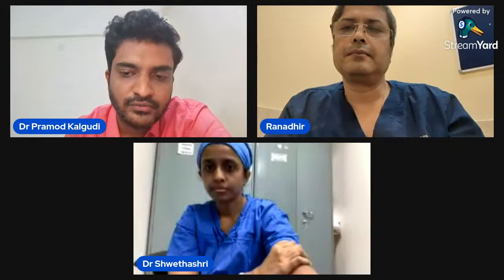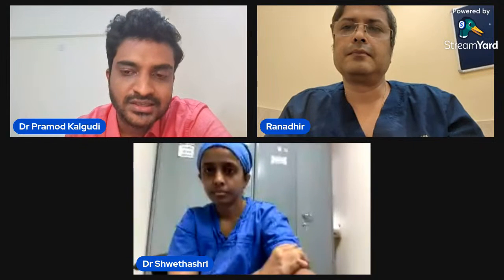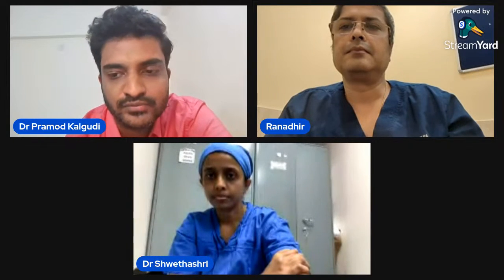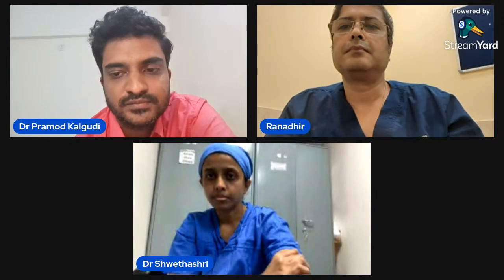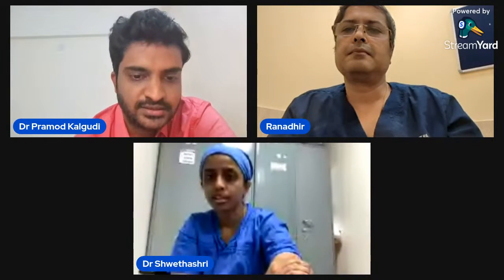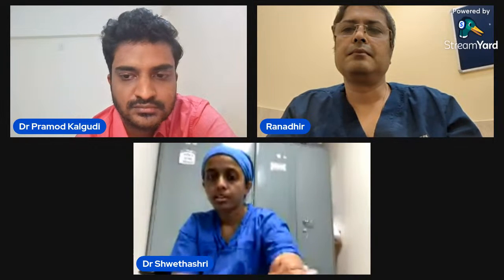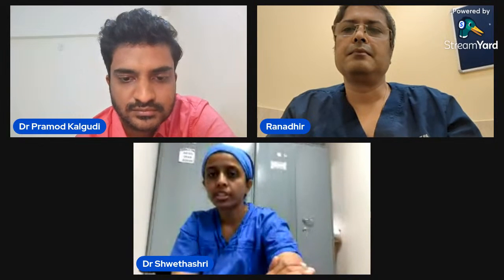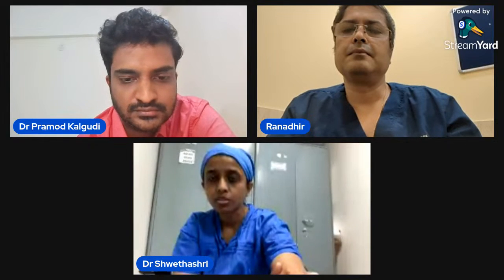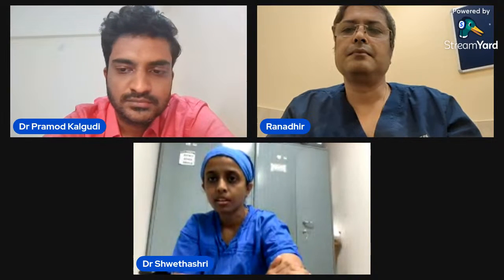Probably going forward, we may even get the velocities and the literature from the TCCD as well, with robust evidence. And also these presets can actually be created earlier itself, like the way Dr. Pramod said, like the arterial, the venous, or probably even the neck vessels. The presets can be created so that they can be easily used instead of adjusting all our filters at the time we are doing it. So if the preset is created, within a few seconds we should be able to insonate the vessels.